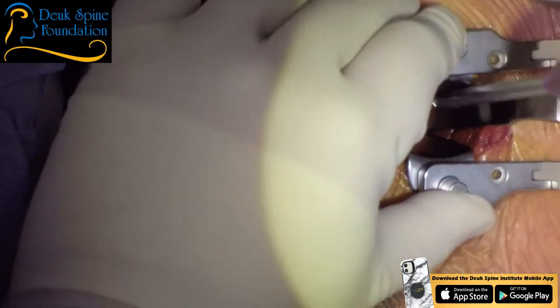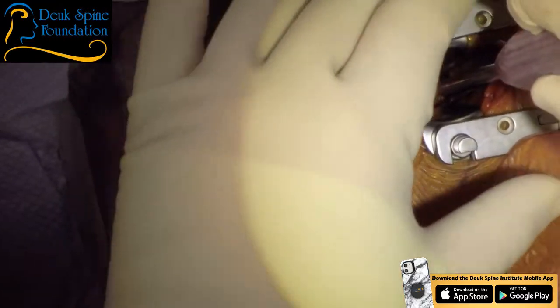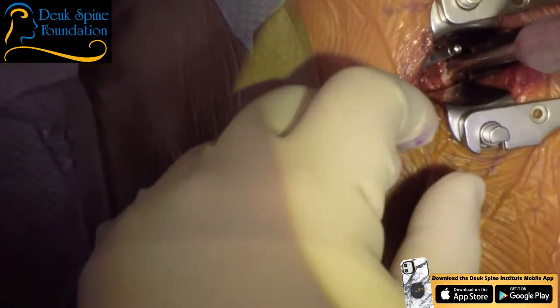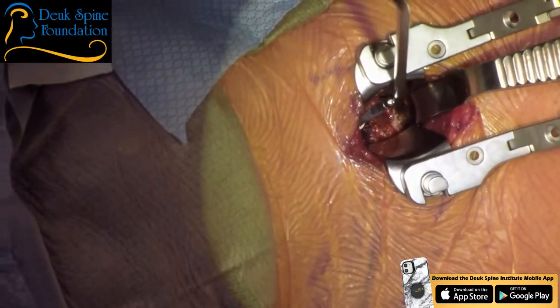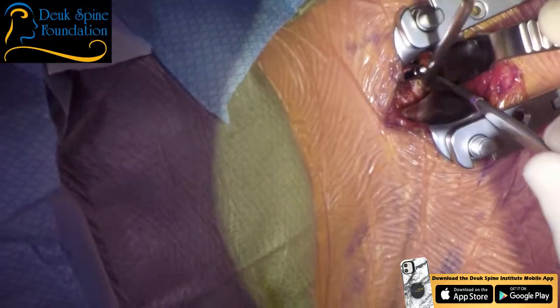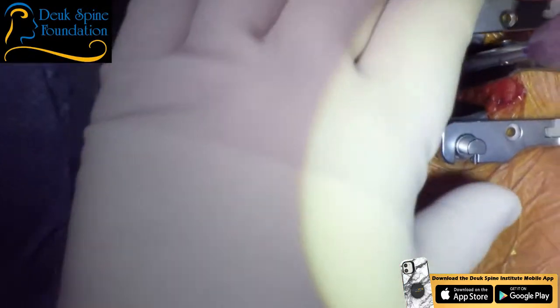Okay. Yes. So you wanna put the post square in the middle of the vertebral body, right at the margin of that soft tissue. And you want it to kind of be parallel. You don't want to go through the end plate. Let me see. That looks pretty good. Where's the end plate? Let me see a Penfield. Okay, you got to put things in my hand in a way I can use them. I got to teach you. Okay, fingertips. Surgeons operate with their fingertips. Okay, good, perfect. So that's a perfect spot for the post.